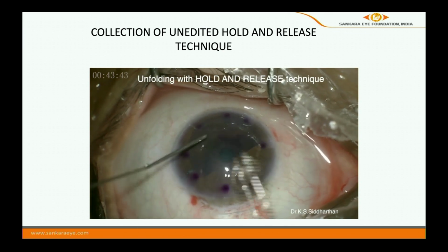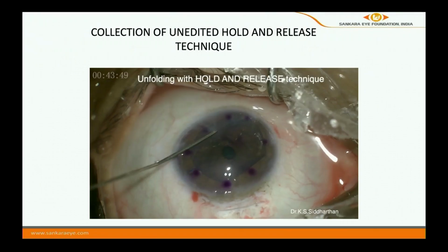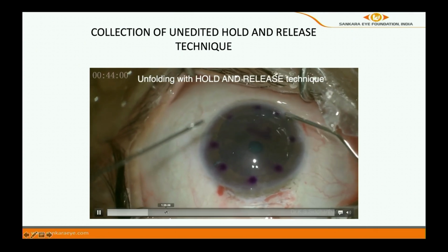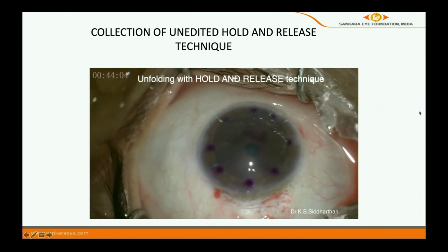I think Dr. Samar Basak does a lot of scleral tunnels. I think you can see that very nicely it unfolds. And see that at 4 minutes, it's unfolded fully. So these are techniques, and this is an unedited video. So I'll be showing another 4-5 where I have not edited it.